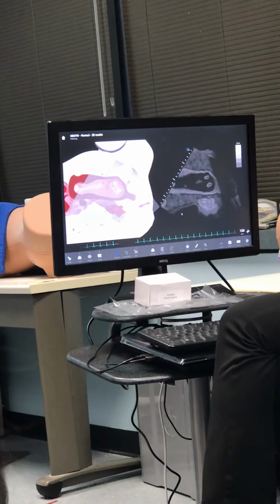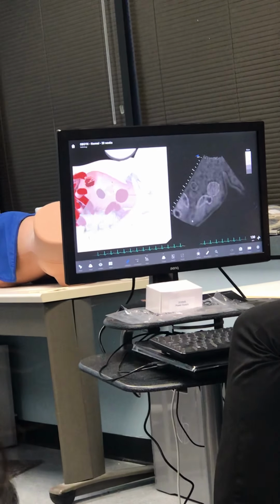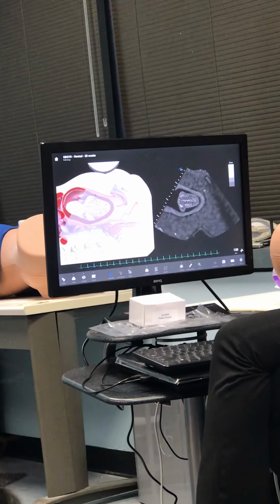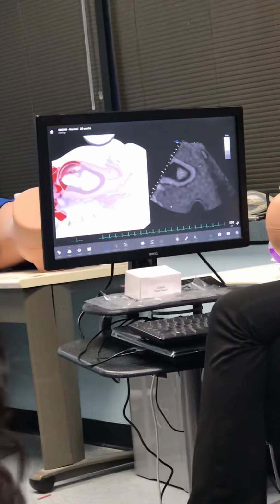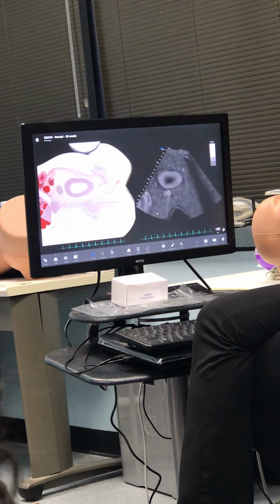Lower quadrant, we're gonna do the same thing, measuring the lower portion. Lower quadrant, same thing, measuring just like in the lower portion of things. So we're doing like that four pocket thing. Yep. Okay. You're fine.